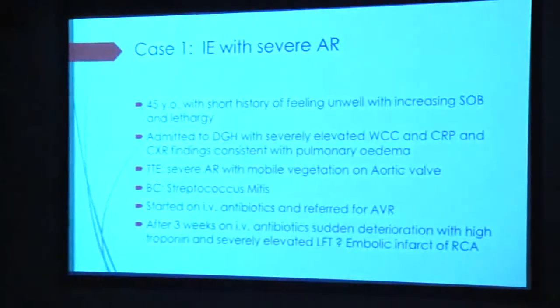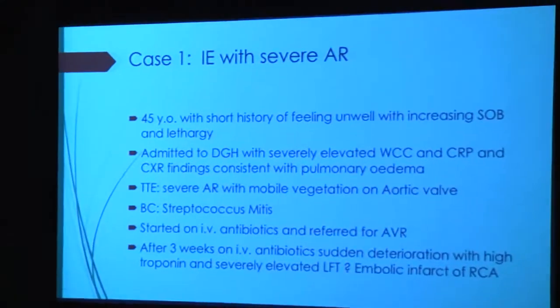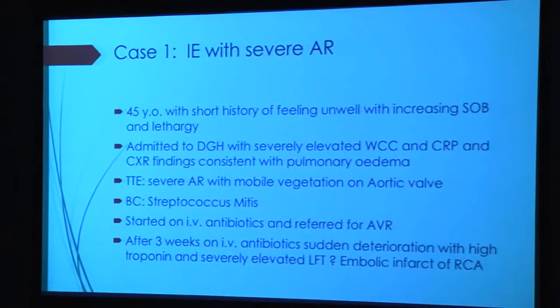So my job is just to tell you about a few clinical cases and apply the knowledge we just acquired from a previous speaker about the assessment of the aortic valve, both in regurgitation and stenosis. So this is our first case.